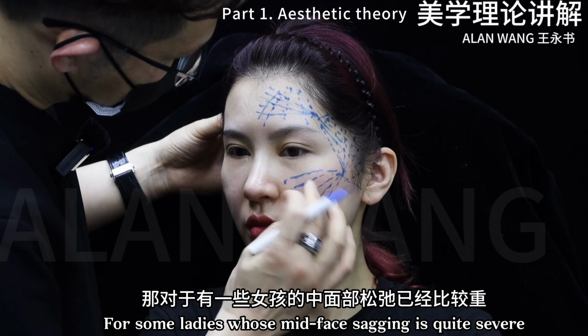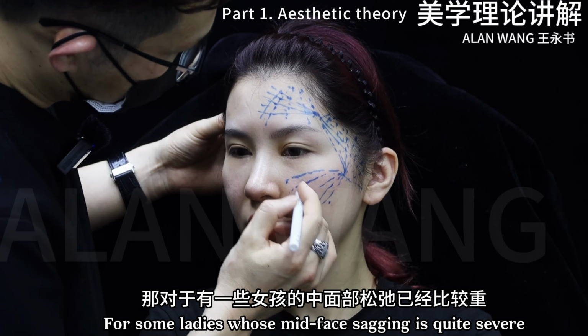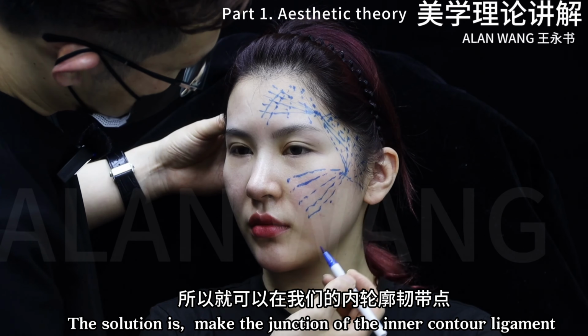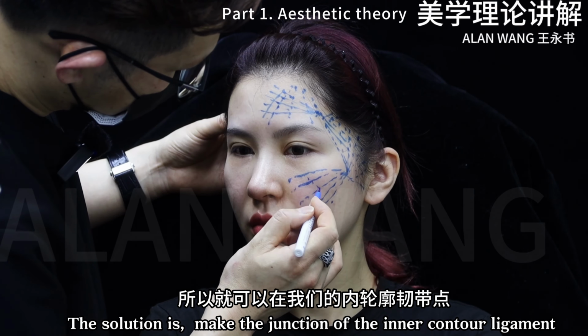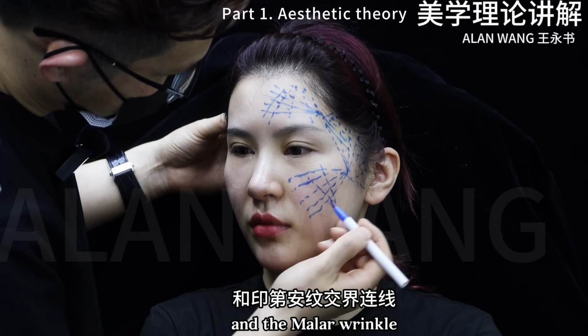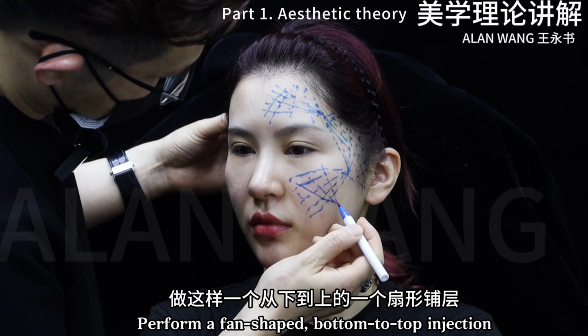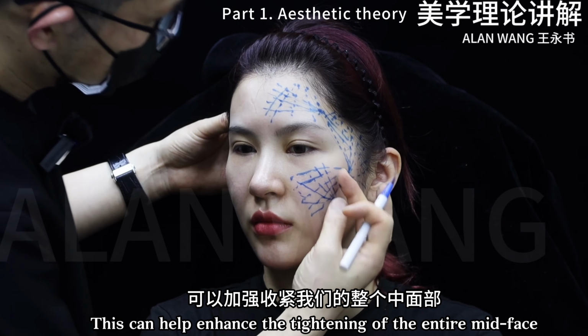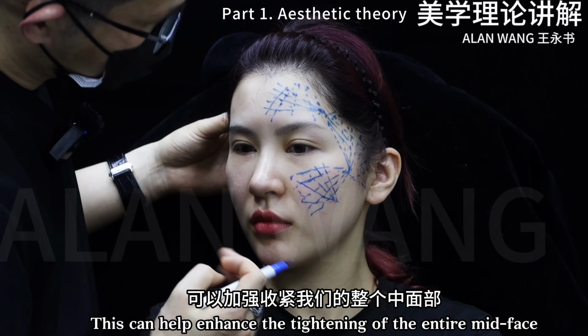For some ladies whose middle face sagging is quite severe, middle wrinkles and tear trough are already looking obvious. The solution is to make the junction of the inner contour ligament and the middle wrinkle the injection point. Perform a fan-shaped bottom to top injection. This can help enhance the tightening of the entire middle face.